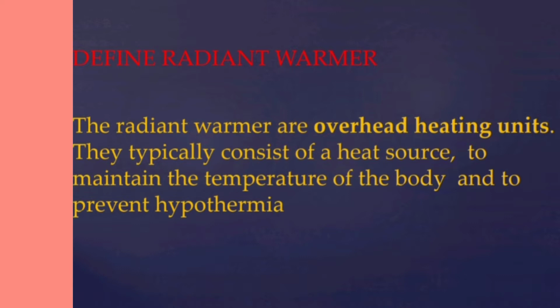Let us see the definition of radiant warmer. The radiant warmers are overhead heating units. They typically consist of a heat source to maintain the temperature of the body and to prevent hypothermia.